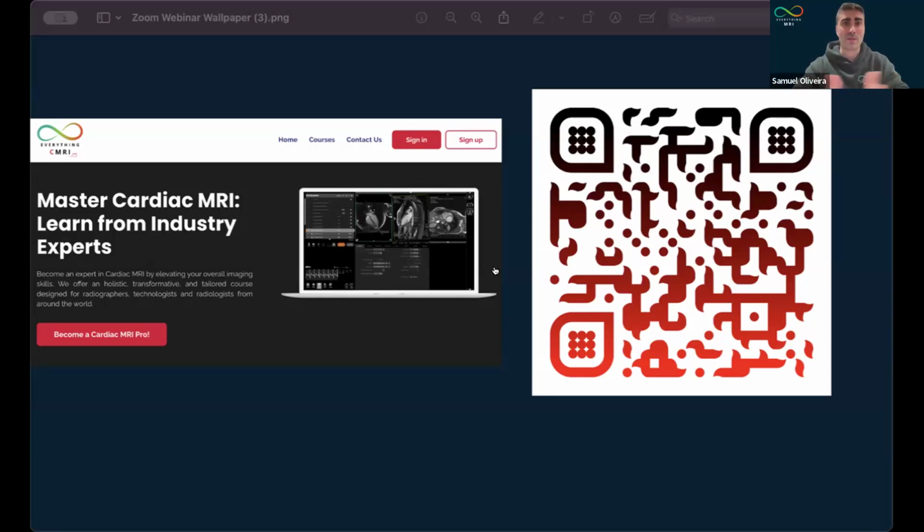Julian, do you have any questions? Yeah, no, I think it was great, to be honest. I just want to feedback one of the slides Emmanuel provided, which was great. With my personal experience, there was a beautiful slide about a patient having a double hip replacement, saying that we need to be particularly careful. And he also included the MHRA guidelines. And I have to say, the only burn that I have experienced in my life was on a patient with double hip replacement. Yeah. So, this gives you the idea.